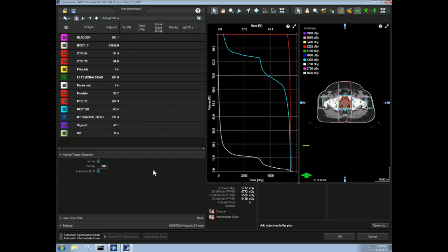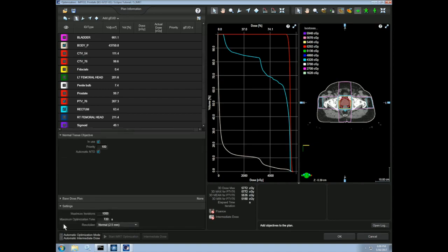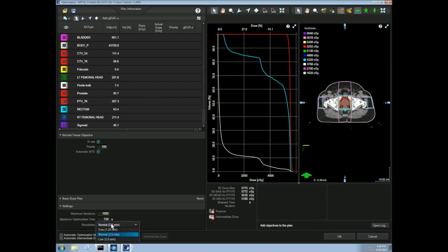We have some other settings that can be useful in the settings tab. We can specify a maximum number of iterations or maximum time for optimization algorithm to limit the computation time. More importantly is the resolution. We can specify how fine we want our optimization algorithm's fluence grid to be. The finer our resolution, the longer optimization time, but the tighter our dose distribution can be.